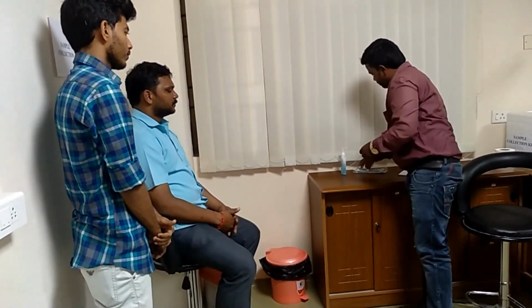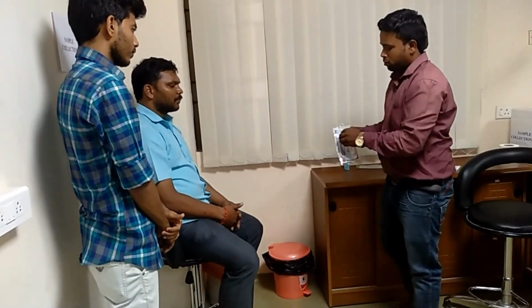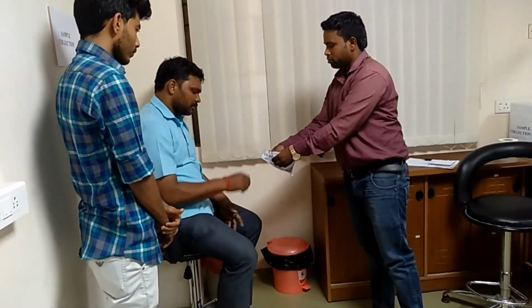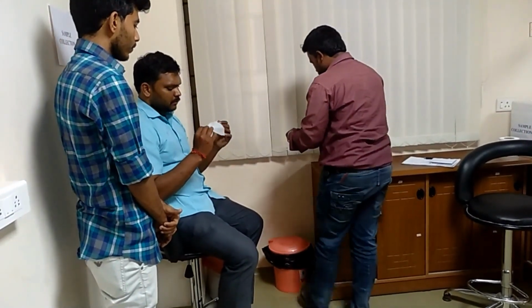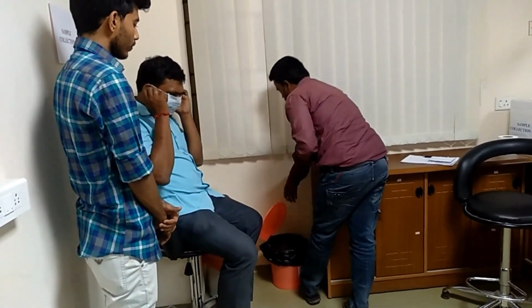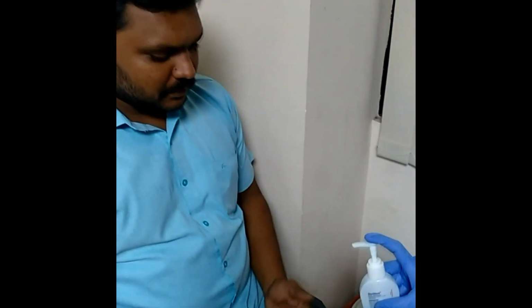If the patient is symptomatic, they should be given a mask to wear and alcohol-based sanitizer to disinfect his or her hands. You need to explain to the patient that if they are going to sneeze or cough, they need to turn away and cover their nose with tissue paper and dispose of it in the biowaste bag.